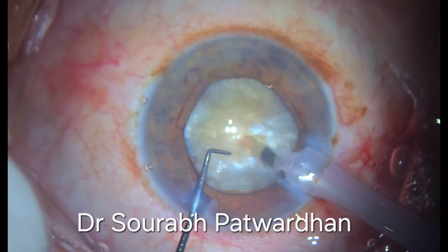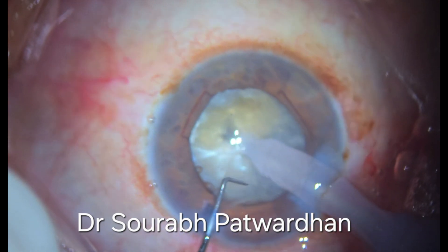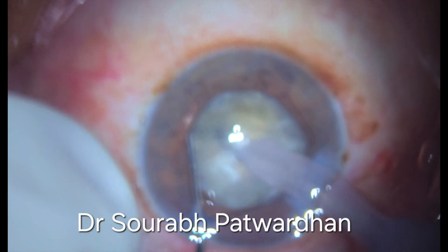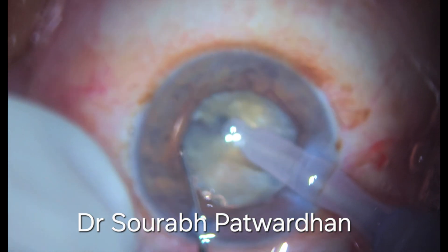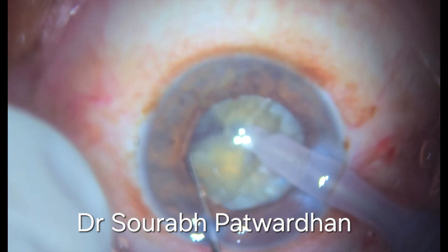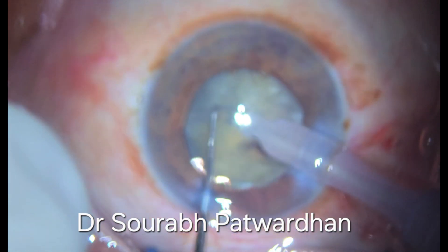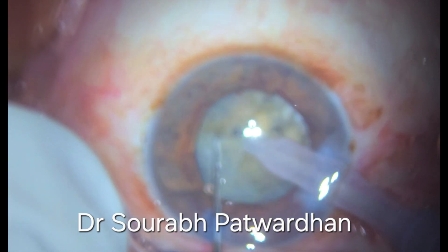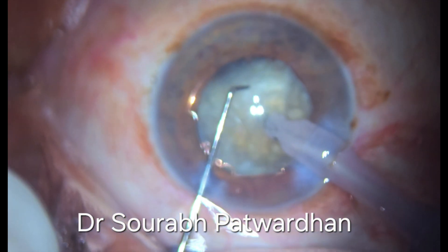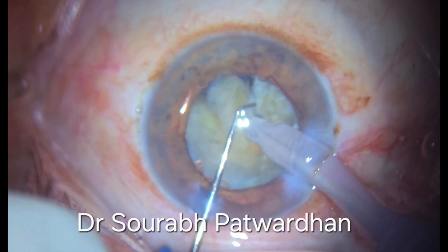Now I am going to do a little fast forward of the phaco. This is a kind of white cataract, not very very hard, but yes it's grade 3 to 4 I would say. And I am going to make a deep trench first. Now here I am using the S24 Ultra phone on autofocus mode and that's why you can see it has lost its focus. So it's probably a better idea to use it on manual focus mode to get fixed focus during the surgery. But as you can see, though blurred, I could chop this nucleus into six pieces and then I am going to emulsify them.